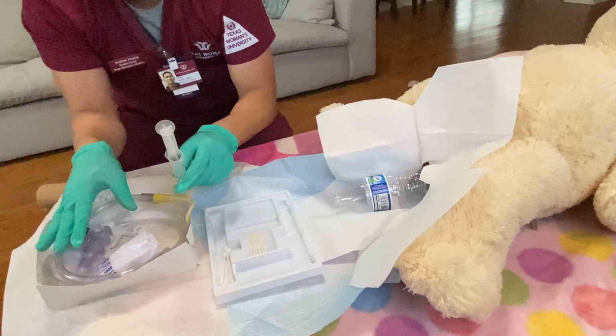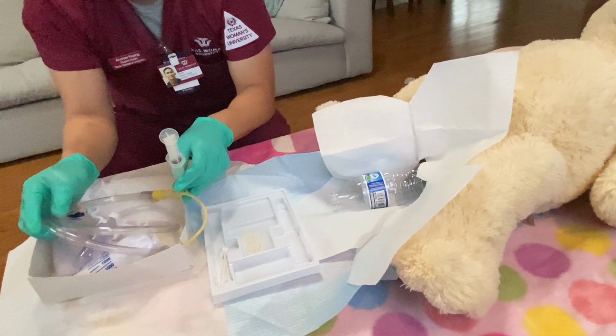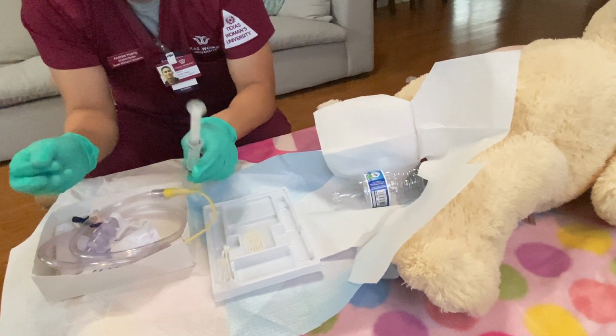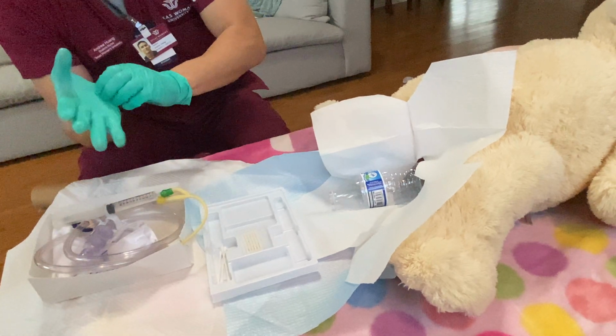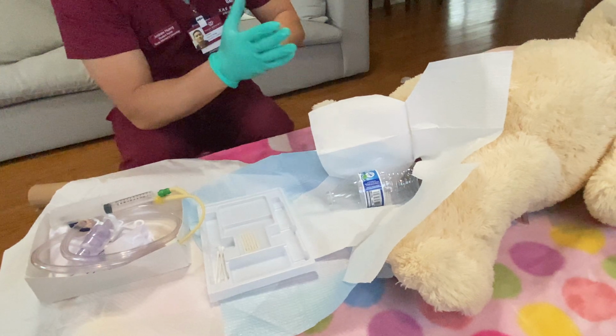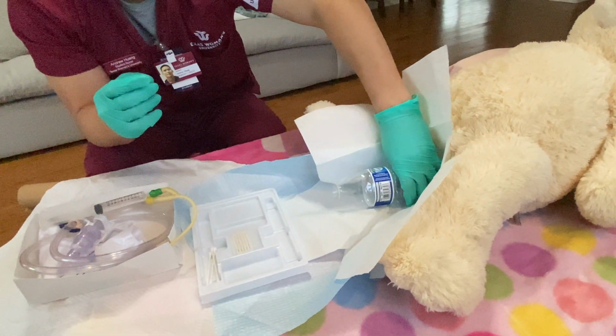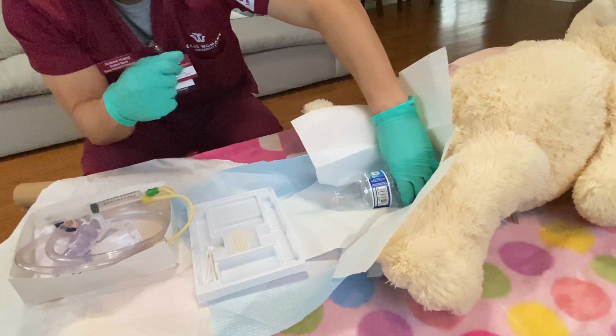And normally I would remove the wrapper from the catheter tubing, but since it's already been done, we don't need to do that. And so I'm going to use my non-dominant hand, and Mr. Jones, I'm going to touch you, and I'm going to put my non-dominant hand and hold the penis in place for the rest of the procedure.